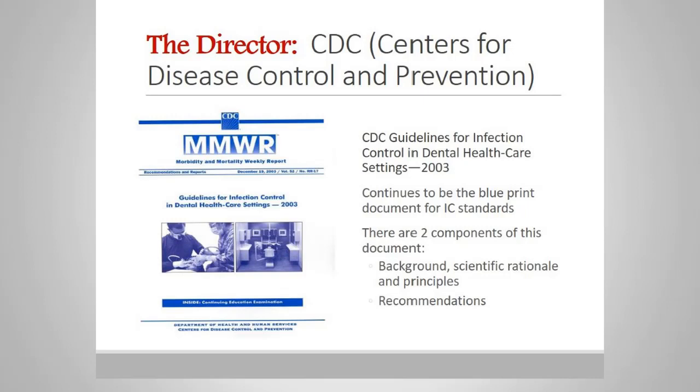So the CDC, or the Centers for Disease Control and Prevention, this document written by the CDC continues to be the blueprint document for infection control standards in the United States. The CDC is an advisory agency, thus the information in this document comes out as recommendations. But keep in mind, many states have taken these recommendations and turned them into law, so keep in mind the local and state dental boards in your area and see how they mention the CDC guidelines, because this may be regulatory in your specific area.